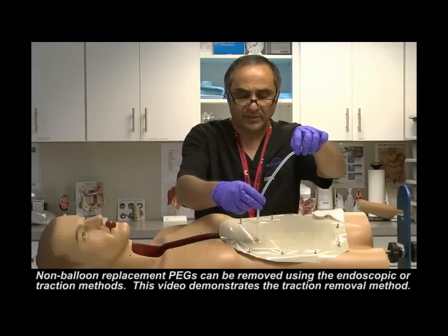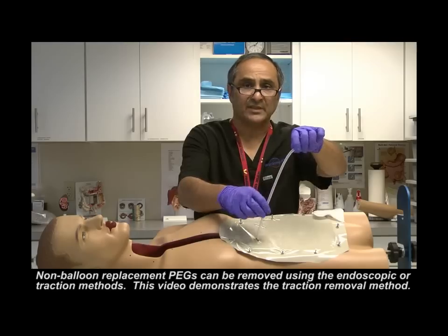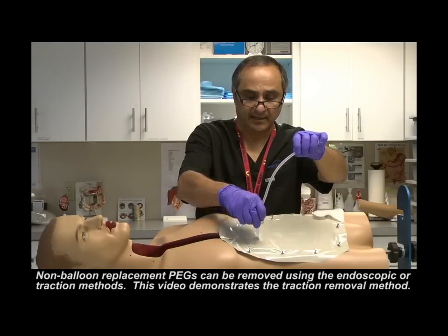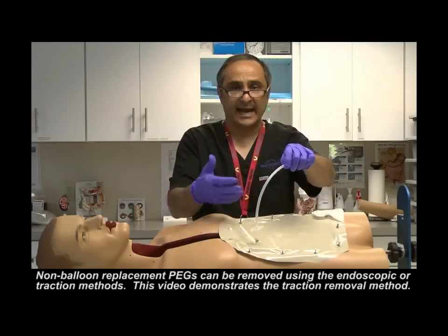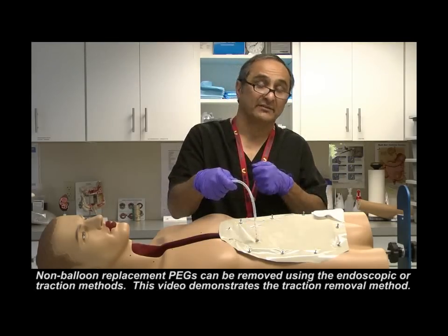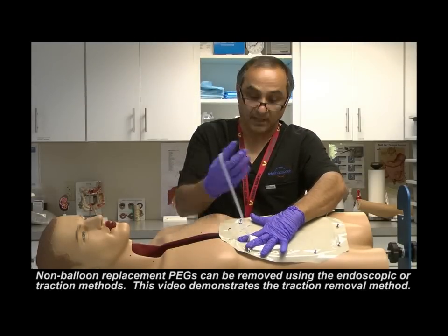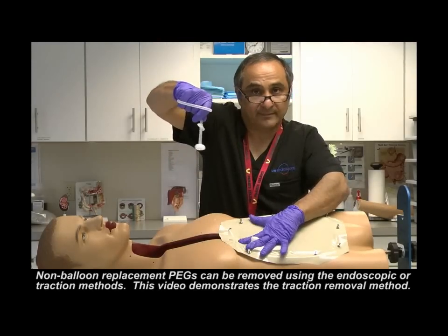I'm also going to rotate the device to make sure that the inner dome, or the interior dome, is not entrapped by any tissue. And I can also slide the device in and out of the stomal tract, as you can see here. So I know now that the device is free and not engaged in any tissue. Then, as with the previous initial placement device, I take my 4x4, cover the site, stabilize the site with my fingers as so, and tell everybody to get out of the way and pull. It's that easy.